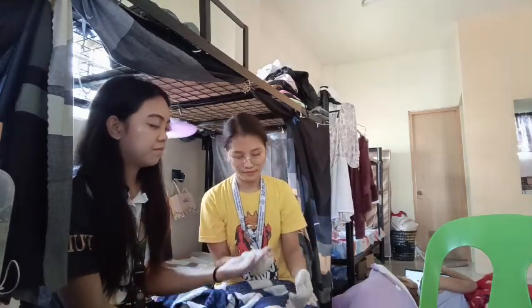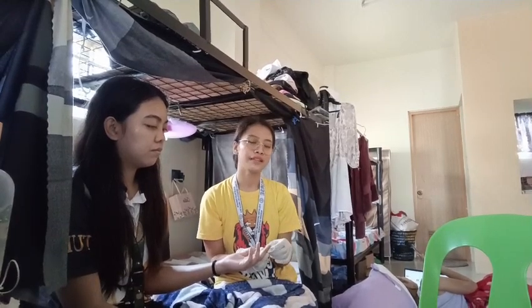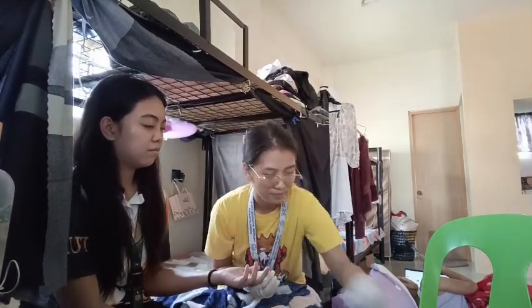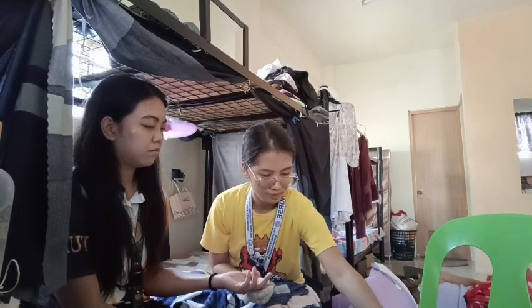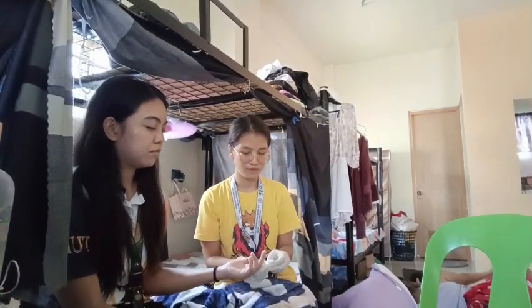Ito na po yun. And also for an adult, massage the side of the finger toward the puncture site. Ito po yung massage, it encourages the blood to flow to the area. And also clean the skin with the alcohol swab and let it dry completely. Then po natin siyang hayaan mag-dry. Alcohol can interfere with the accuracy of the results if not completely dried.